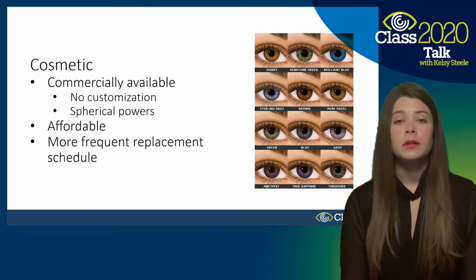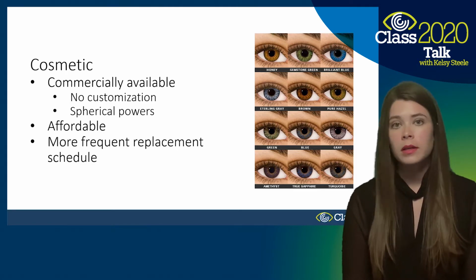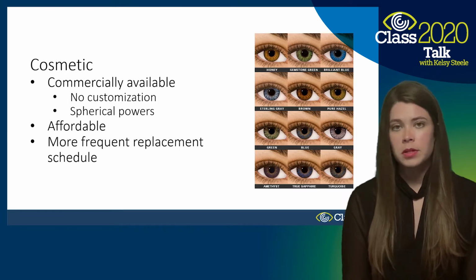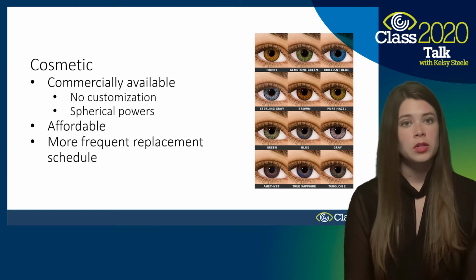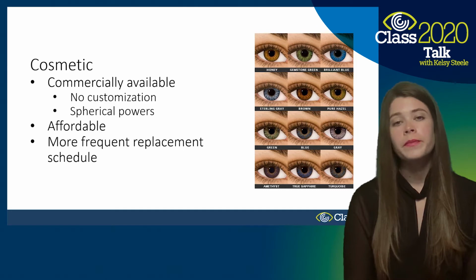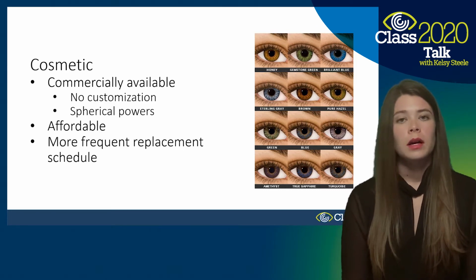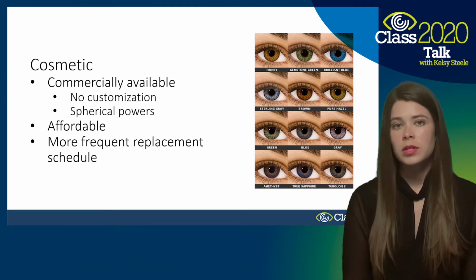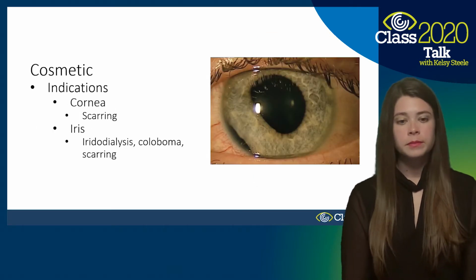Nice thing about these is they're a little bit more affordable. They're very reproducible, so they're always going to look the same. And some of these are going to have more frequent replacement schedules compared to some of our more customized versions. They even have some of these in a daily disposable. So if you have a patient that is just a sometimes wearer, that might be an appropriate option for them. As well as if you have a patient who's had problems with contact lenses in the past as far as inflammatory or infectious conditions, they might do better with a more frequent replacement lens.